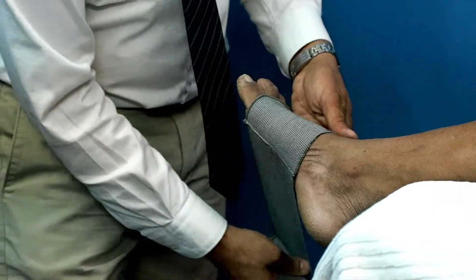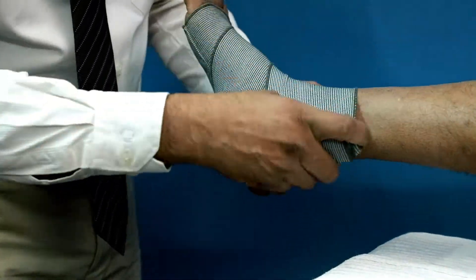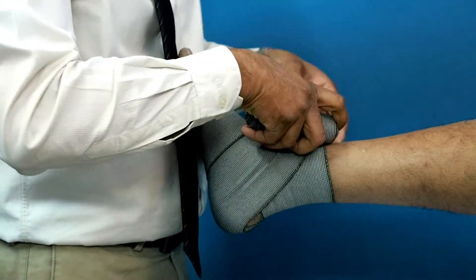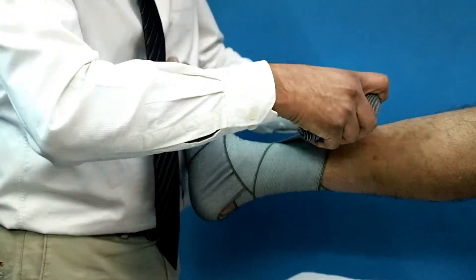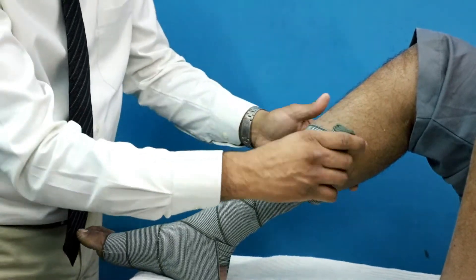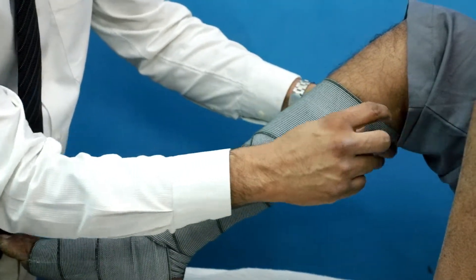So we start here. We are taking a turn, while I am stretching the bandage to the maximum extent, and gradually I will be reducing the stretch. Then we need to go back once, go forward, go back and then again go forward. By going up, we need to gradually reduce the pressure.